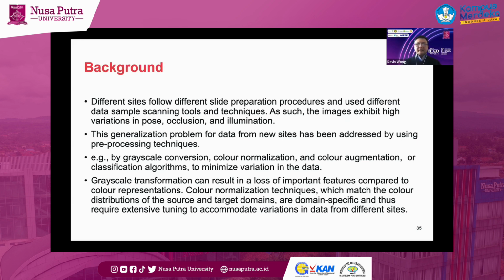Depending on the scanner itself, and on some of the environmental conditions, when you prepare the slide or the WSI, it could be different. In image processing there are a lot of other techniques you can look at, for example grayscale conversions, color normalizations, color augmentations, and so on, to try to match the differences between sites as much as you can.